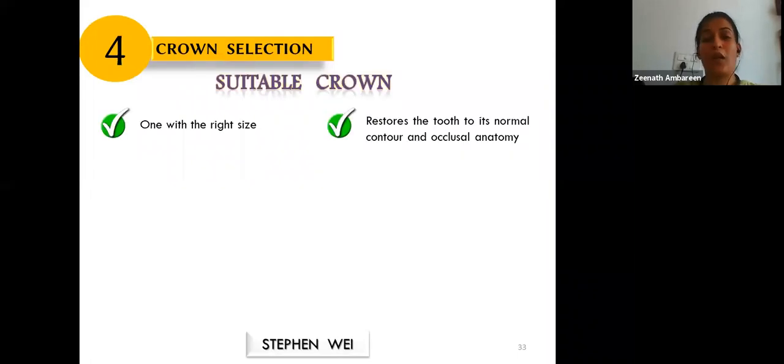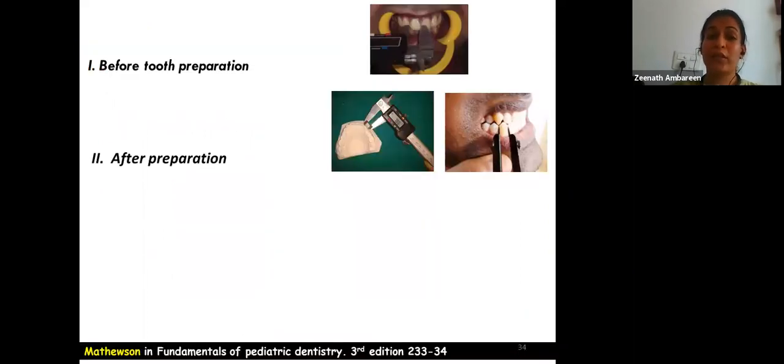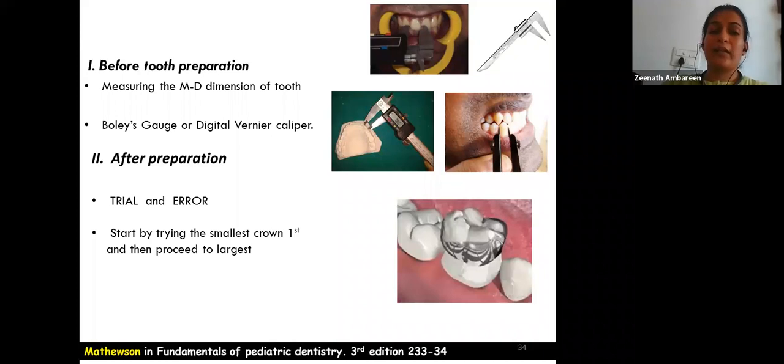The crown of the right size that restores the tooth to its normal contour and occlusal anatomy is selected. Since primary teeth undergo attrition, a crown with a large, well-defined cusp is not appropriate. Crown selection can be done before tooth preparation by measuring the mesiodistal dimension with a Boley gauge, digital vernier caliper, or divider and ruler — or after preparation using a trial-and-error method starting with the smallest crown.